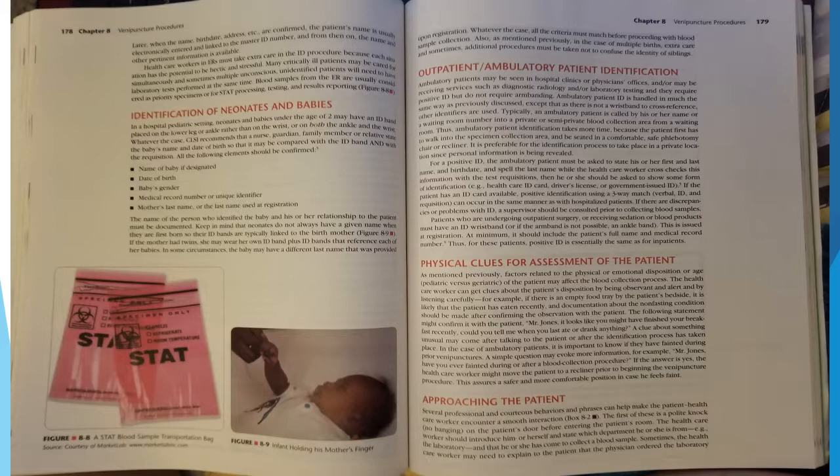Identification of neonates and babies. In a hospital pediatric setting, neonates and babies under the age of 2 may have an ID band placed on the lower leg or ankle rather than on the wrist, or both the ankle and the wrist. Whatever the case, CLSI recommends that a nurse, guardian, family member, or relative state the baby's name and date of birth so that it may be compared with the ID band and with the requisition. All the following elements should be confirmed: name of baby if designated, date of birth, baby gender, medical record number or unique identifier, mother's last name, or the last name used as registration.